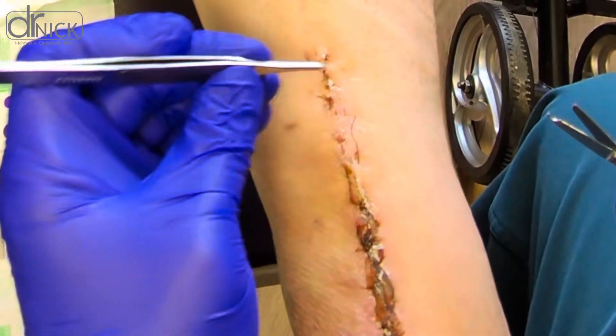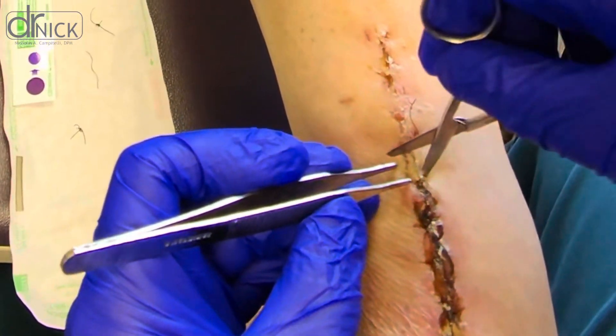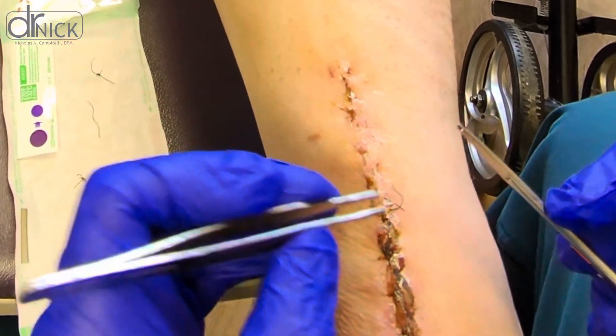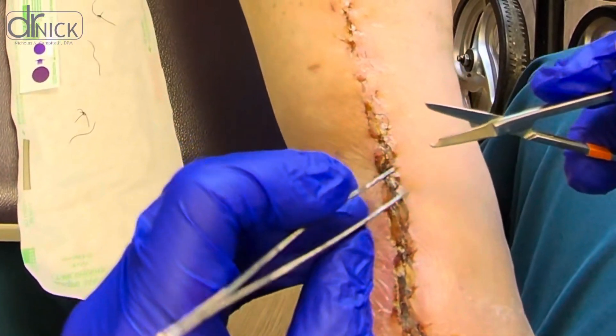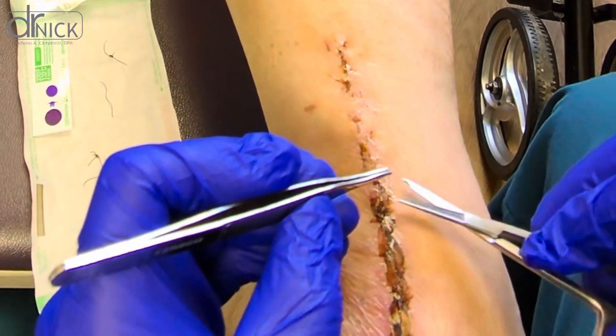The healing process for an Achilles can take several months and removing the sutures is a crucial step toward recovery. First, I gently clean the area around the incision to ensure it's free of any bacteria. Then with precision, I carefully cut and remove each suture. The key here is to be gentle as the tissue is still healing.